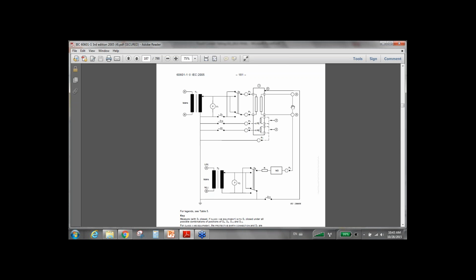which is connected to your device through the patient lead. This mains and applied part could be looked at as an example where a patient could come in contact with a line voltage, a secondary source, which will be any kind of other line voltage, and they're still connected to your DUT. So what effect would the person have if they experience this situation where they're connected to line voltage on one end, connected to your instrument or your patient lead on the other side?